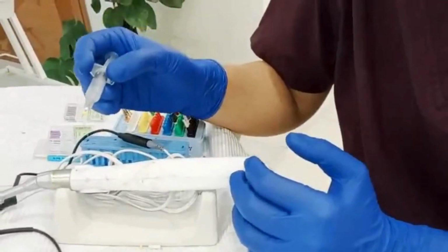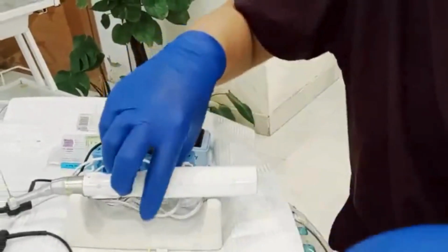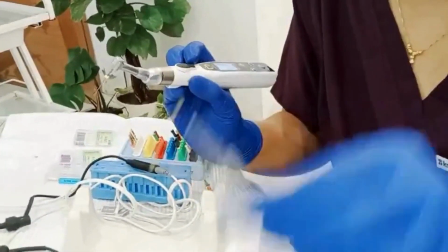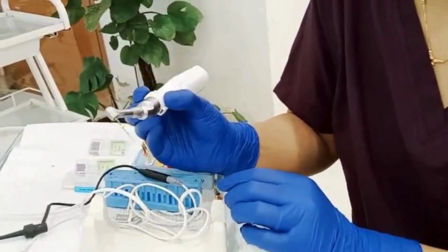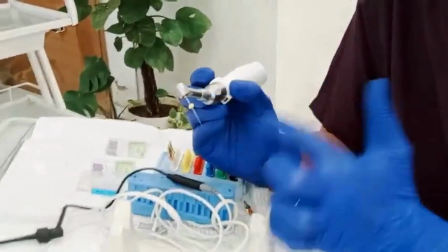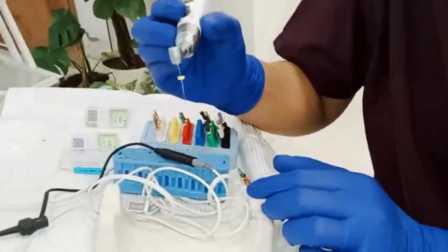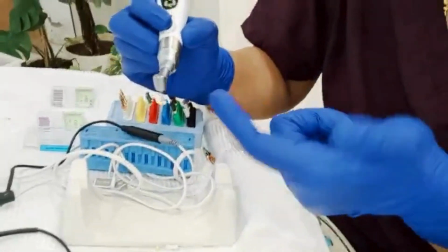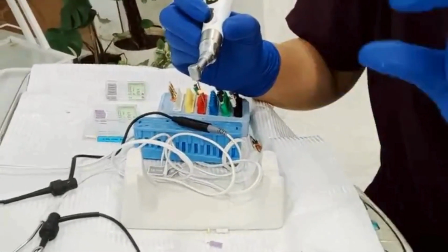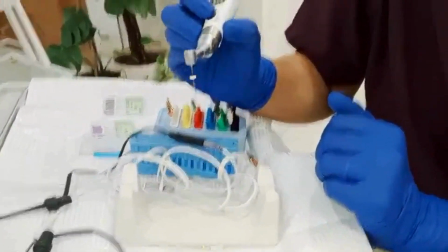So we'll place hypo inside the canal. Okay, we'll put hypo inside the canal, and then we have to activate it with the endo activator, and then we'll use filing. These files clean and shape the canal, while hypo cleans the canal. So this will go inside the canal just like this, and we'll use a stopper till our apex or the working length we have taken earlier. So it will go like this inside the tooth.